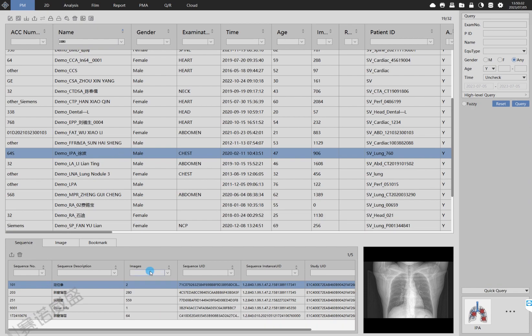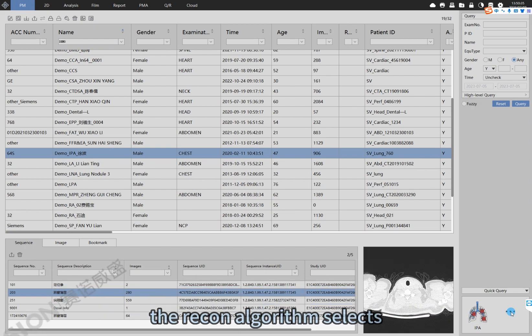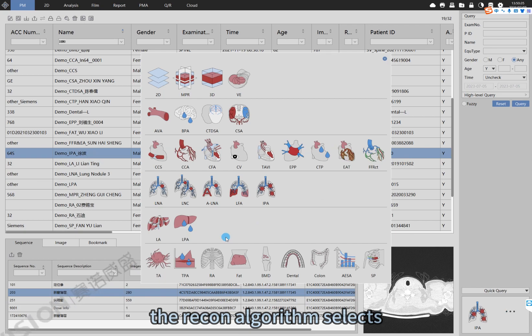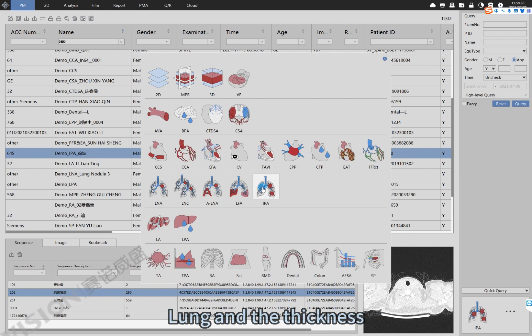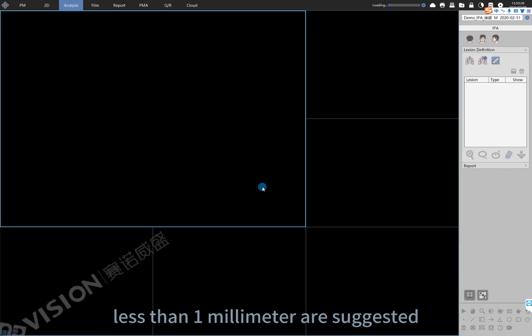First, select a sequence, then load it to the Intelligent Pneumonia Analysis IPA. The recon algorithm should be set to lung, and a slice thickness of less than 1 mm is suggested.